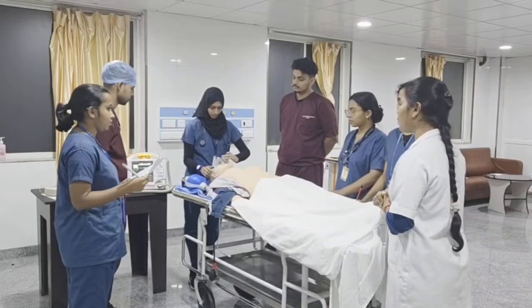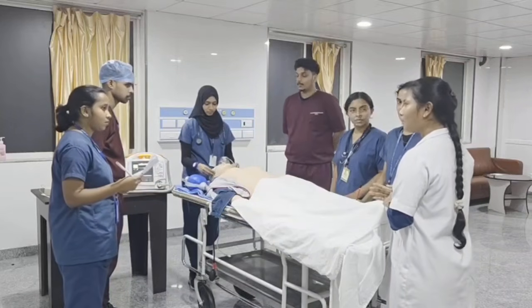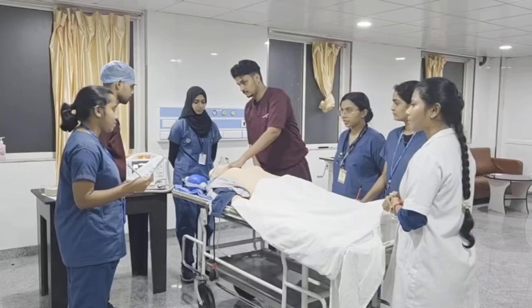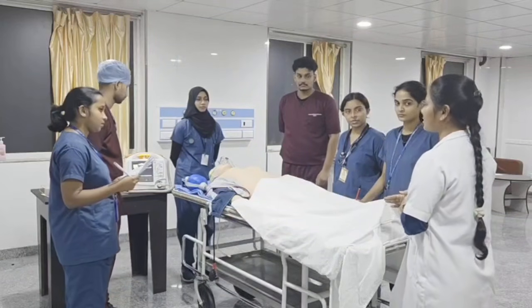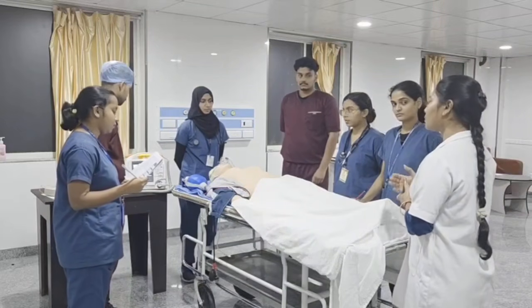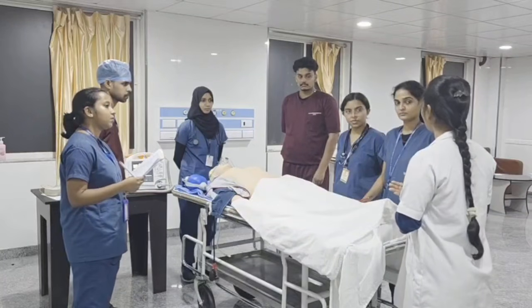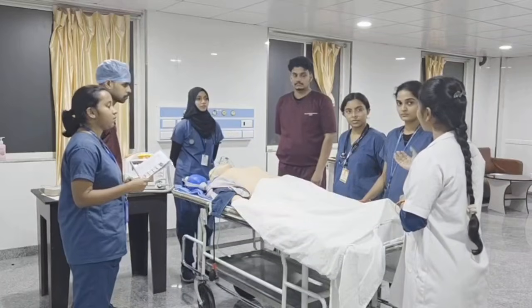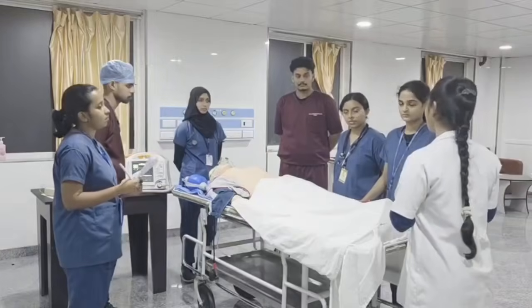So the monitor is showing a wide complex regular tachycardia. So it is a monomorphic VT. Could you check for pulse? Pulse is present. So the patient has a pulse and the vitals show the patient is in unstable condition. So we are supposed to proceed with synchronized cardioversion. Before that, we are supposed to first sedate the patient, take consent and then keep the crash cart ready. So Ashwini, you can prepare the sedative medications. Nandini, you can go and take consent from the bystander.